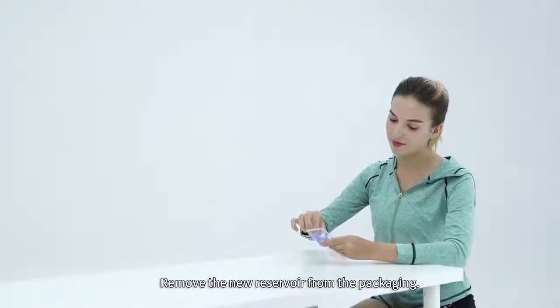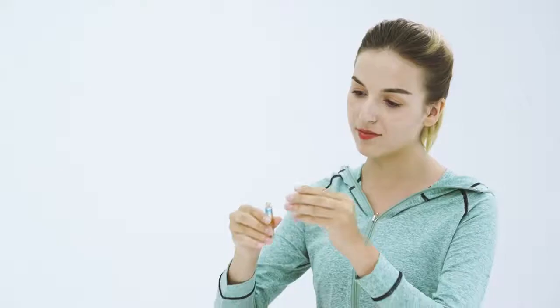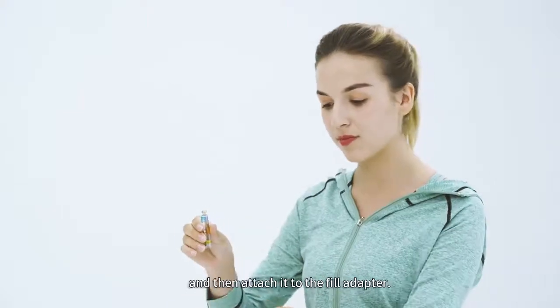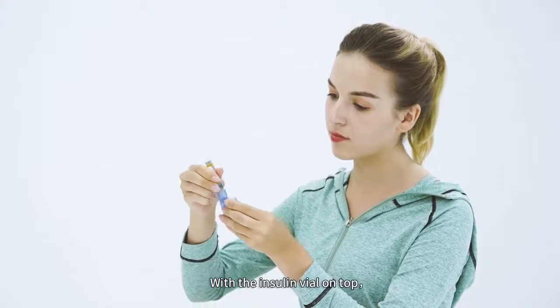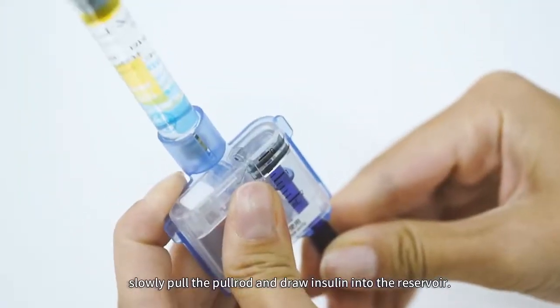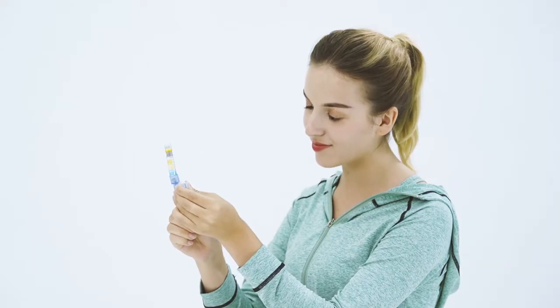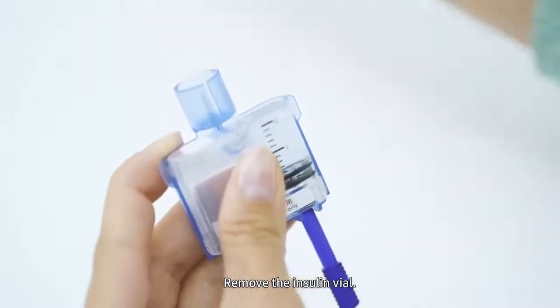Remove the new reservoir from the packaging. Use an alcohol pad to clean the insulin vial and then attach it to the fill adapter. With the insulin vial on top, slowly pull the pull rod and draw insulin into the reservoir. Remove the insulin vial.